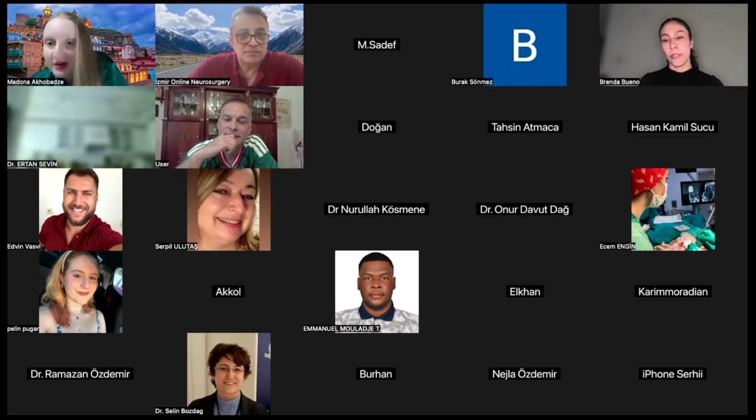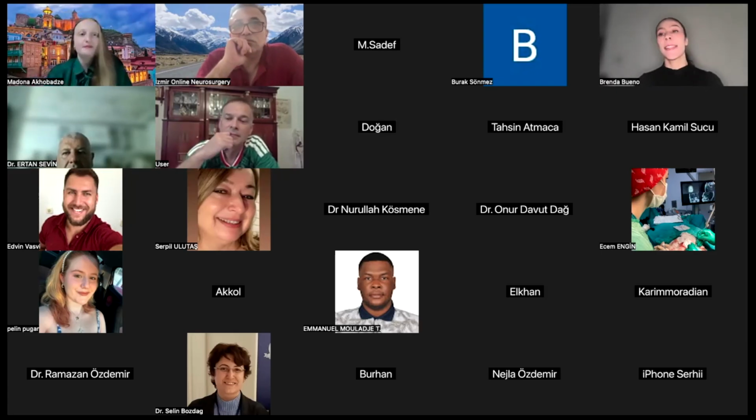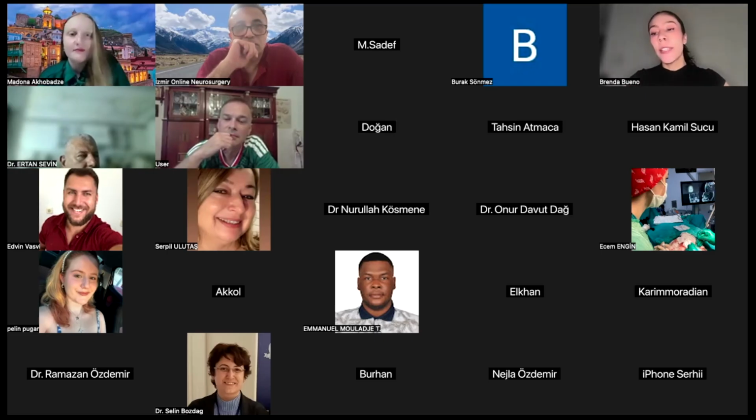What are your experience or key technical tips regarding the UBE technique in revision cases, especially for patients with a history of prior implant infection? Does UBE offer a significant advantage in minimizing the risk of recurrent infection? Yes, some tips I can give you. The starting point is, like I said, if this patient has unilateral work, go contralateral, but if it's bilateral, you plan an MRI.